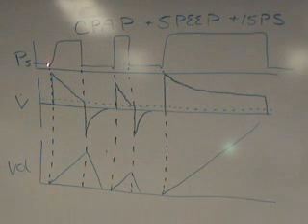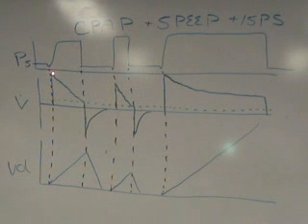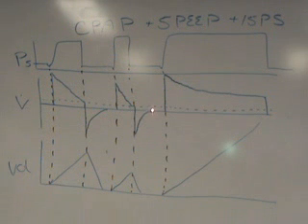So the breath was initiated by the patient. The breath went to a pressure level, stayed at the pressure level until the flow rate decelerated, and then when the flow rate decelerated to this terminal sensitivity, the patient exhaled. The next breath, the patient triggers. It goes to the preset pressure support level. The flow rate decelerates to that terminal point, and then the patient is allowed to exhale.